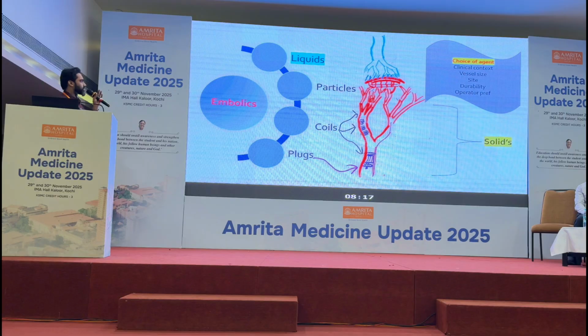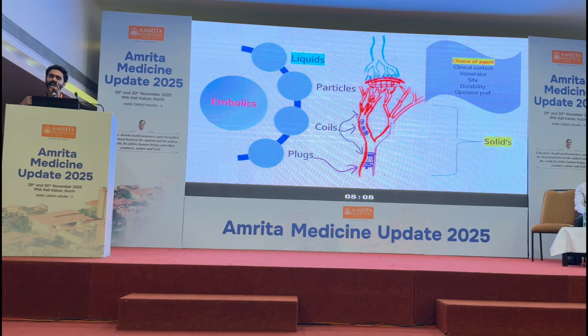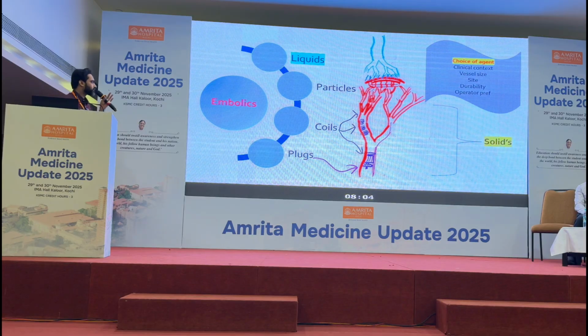So this is what I was saying. We choose to use liquids, particles, coils, plugs, depending upon the site we are going to embolize and our desired result, whether we want to embolize it permanently or we want to have only a temporary embolization.